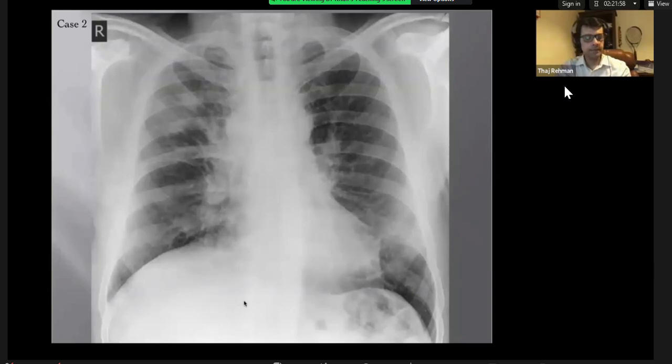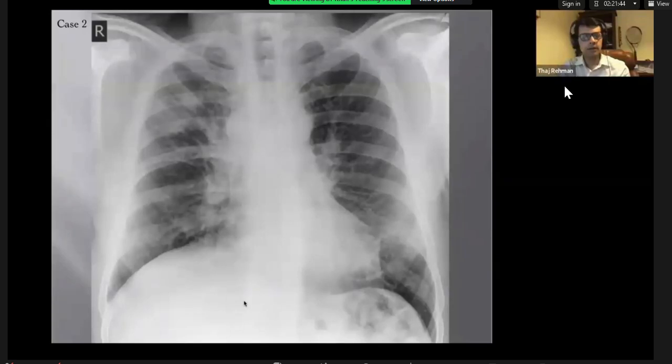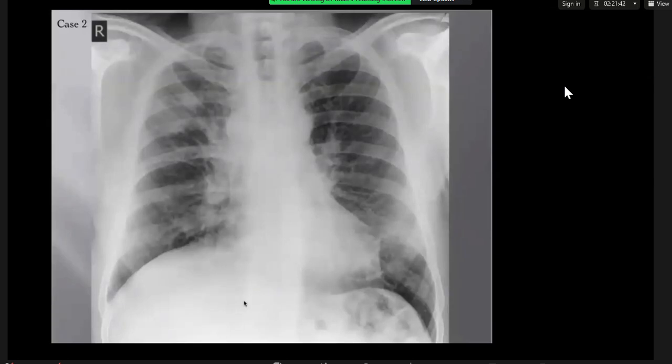Okay, I can see the X-ray quite well because I'm logging in and logging out. Yeah, and Samir Khan has just texted me. Screen is fine for him as well. Okay, I think it's probably more my internet than yours then. Yeah. Okay, right. So are you telling me you can't see the radiograph at all? No, I can. It's just not very clear.